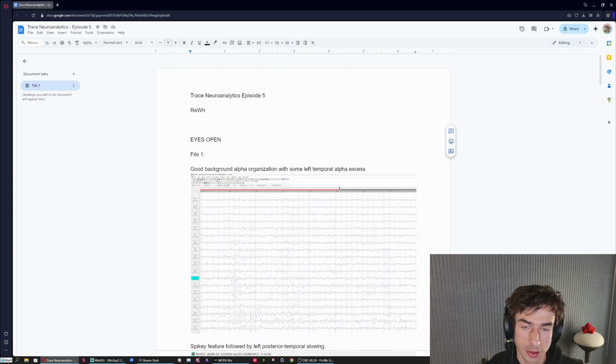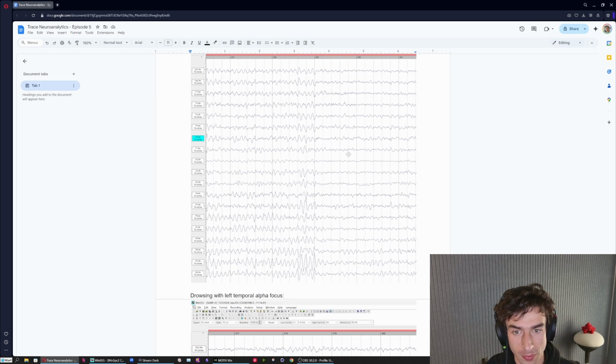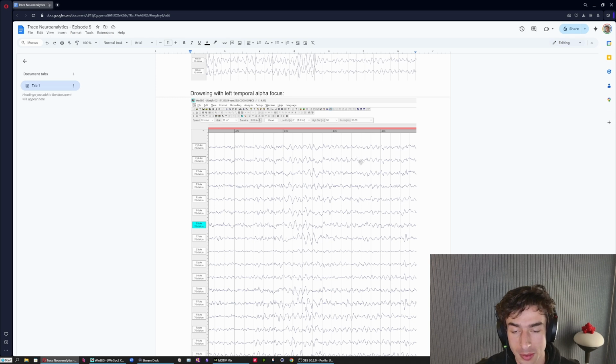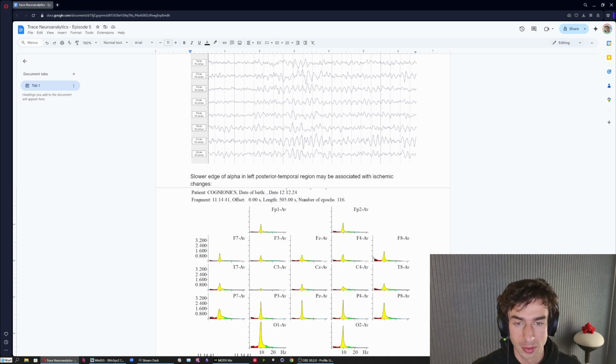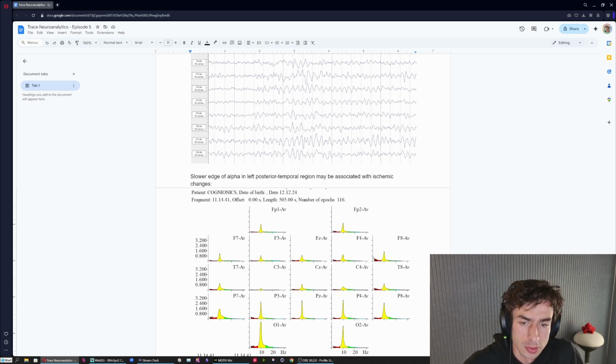Okay, so this looks like a great EEG recording overall. And as far as what's going on in this brain, seems like a very healthy brain overall. I'm not sure the age of this individual, but the 10 hertz alpha tuning, certainly nothing wrong with that.